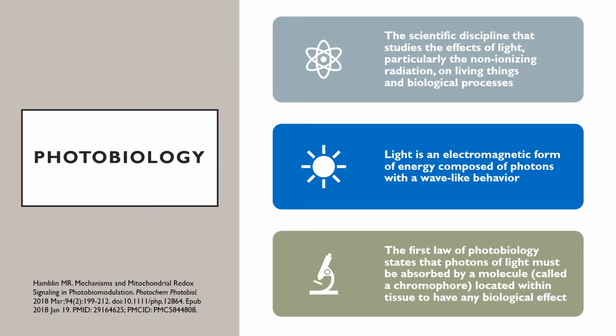So let's get started. What photobiomodulation is, and that's a new term for all of us. I can't imagine any of us went to optometry school and had some type of photobiomodulation or photobiology class. But surprisingly, in a way, we know half of this stuff already. And by virtue of us being optometrists, we actually learned a lot about photobiology.